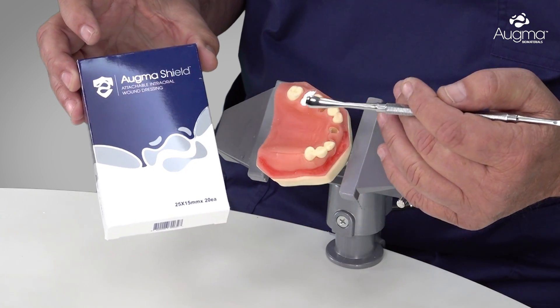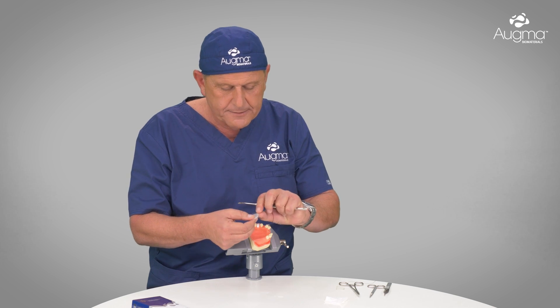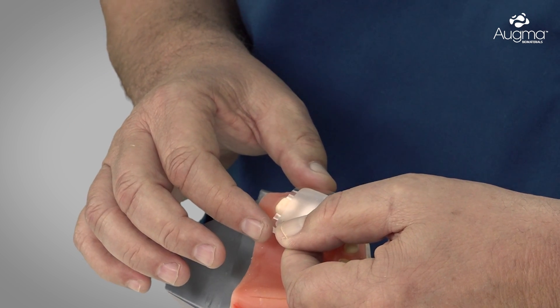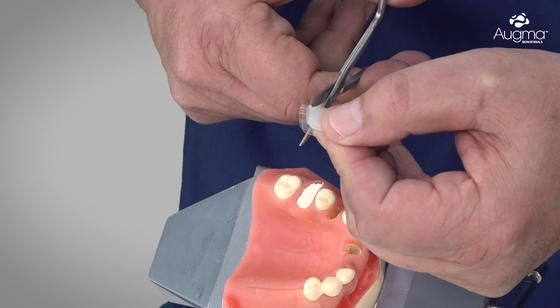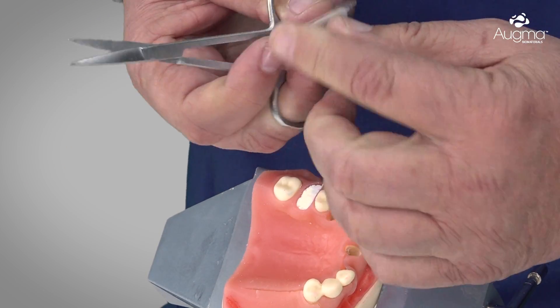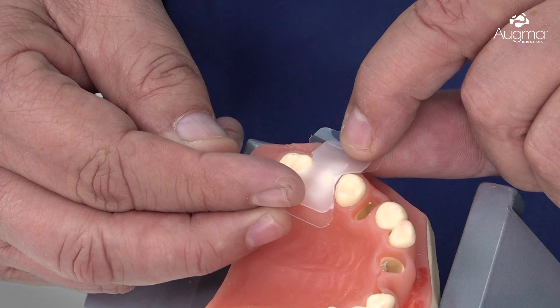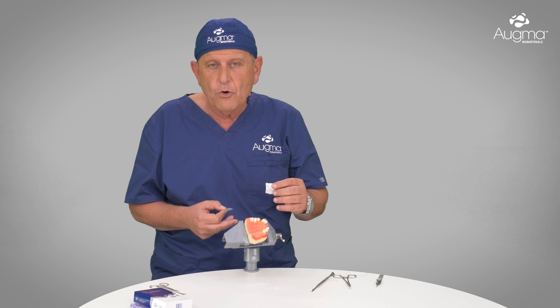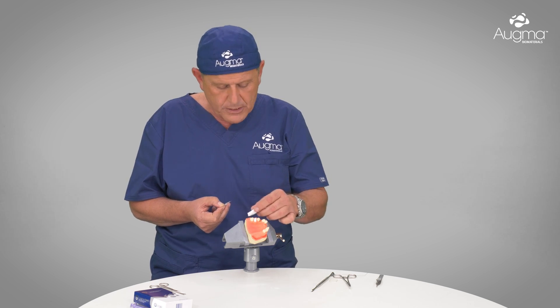The OGMA Shield is a wound dressing made from polymer that is almost completely resorbed, but it will provide sufficient protection until soft tissue proliferation takes place and bridges the gap between the incision lines. To adapt it to the socket, I bend it in half and cut two triangles from the sides in the middle. Opening it, you can see it is quite well adapted. One important thing: if you want the OGMA Shield to adhere better to the soft tissue, take a moist gauze and clean the soft tissue before applying it.